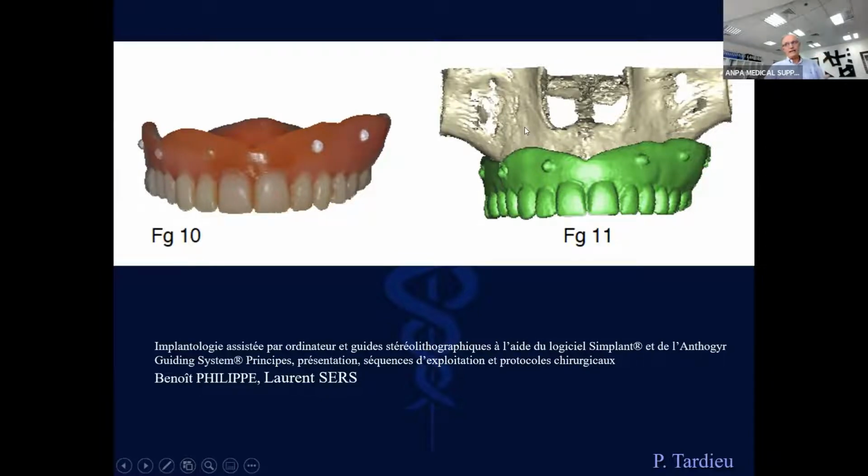You take a first scan with the denture of the patient in his mouth, separated from the opposite arch, biting on cotton rolls. Don't ask the patient to bite teeth against teeth, because we will not be able to know the surface of the teeth and the architecture of the surface. So we need to separate the upper and the lower. Putting in the cotton rolls, we will be able to fully put the denture in the right position. It's like when a patient is biting on articulating paper. You ask them to bite at the level of the first molar and premolar.